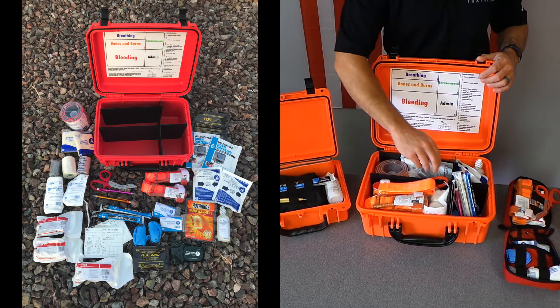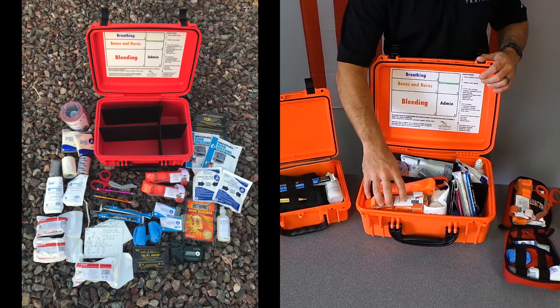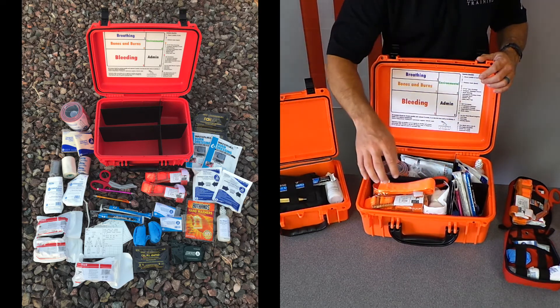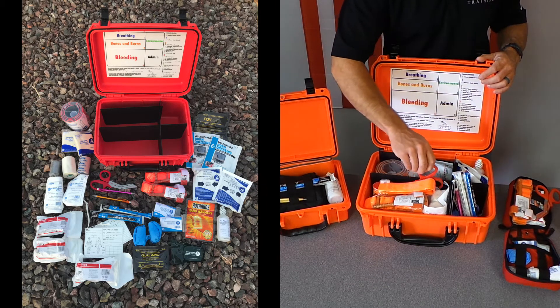We have a bones and burns section with stabilization materials, tape, and burn dressings. Our bleeding section has multiple tourniquets, lots of gauze, lots of pressure dressings, hemostatic blood clotting agent, and of course shears to expose wounds.